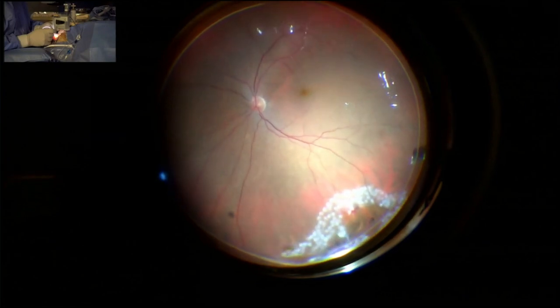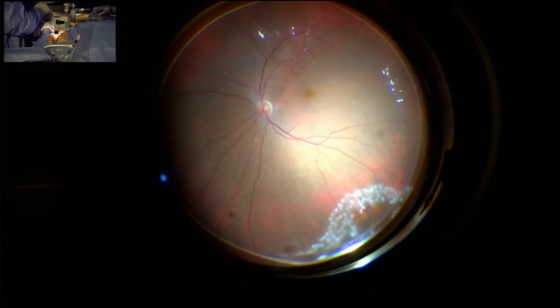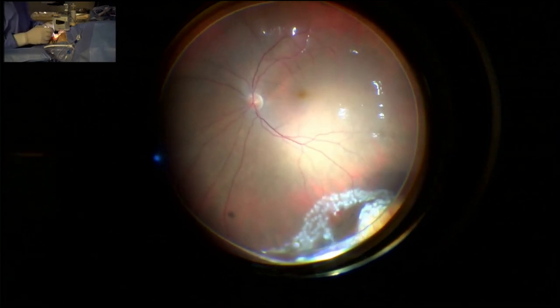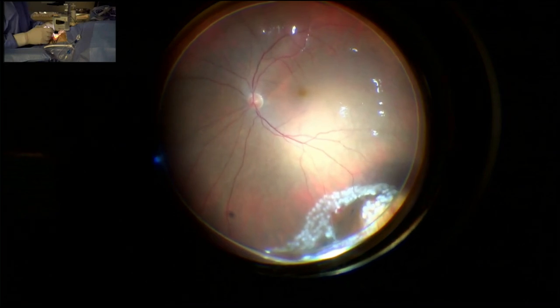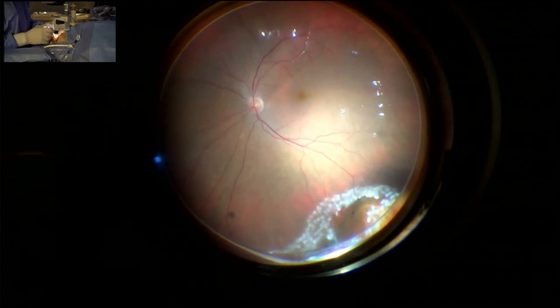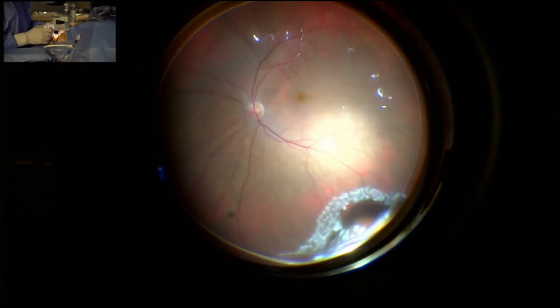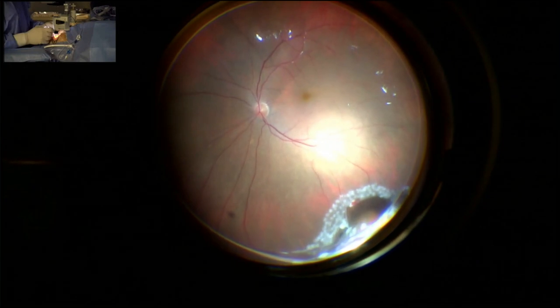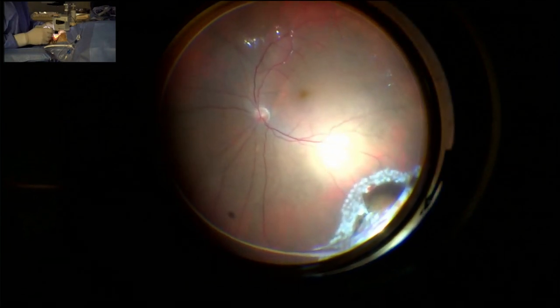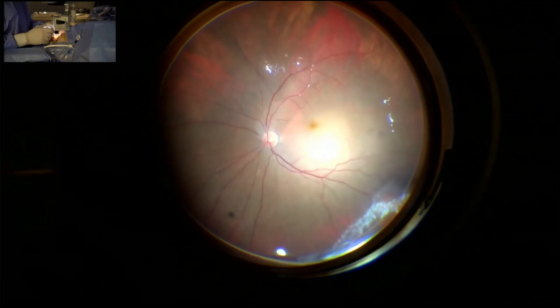During this surgery, with PFO injection, usually I used to stop the infusion and use the backflush to balance the pressure on the vitreous, because there is no reflux of fluid from the infusion. But in the new system, it regulates the intraocular pressure with the smart IOP system, and therefore you don't need to use another instrument. You can inject PFO while the infusion is open, because the infusion goes back during the injection and balances the vitreous cavity. This is one of the biggest advantages of the new EVA system.